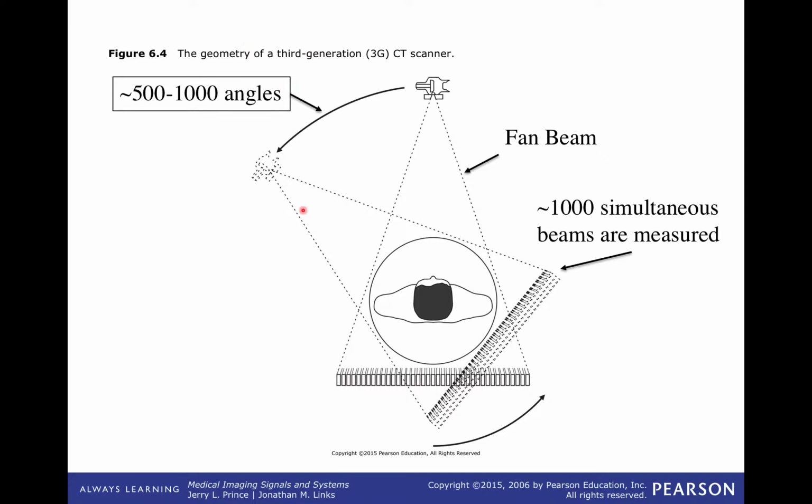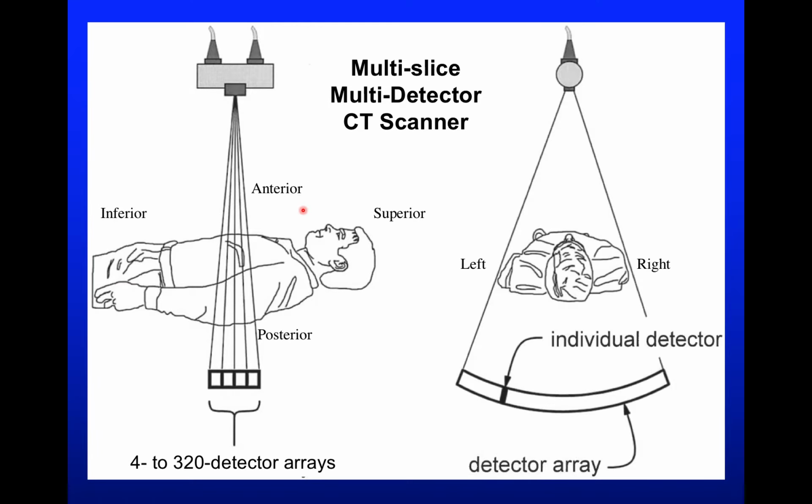And this is called the third generation CT scanner, and the CT scanners basically stayed like this. Small modifications will occur next, but the other modification that occurs is once you have this geometry of a fan beam illuminating the whole field of view and 1,000 detectors down here, well, what's the next way to make things twice as fast, right? Or 4 times as fast, we'll just put 4 detectors like this, and we'll do 4 slices simultaneously, as opposed to doing 1 slice, shifting the patient, doing the next slice, shifting the patient, doing the next slice. Let's do 4 slices simultaneously.